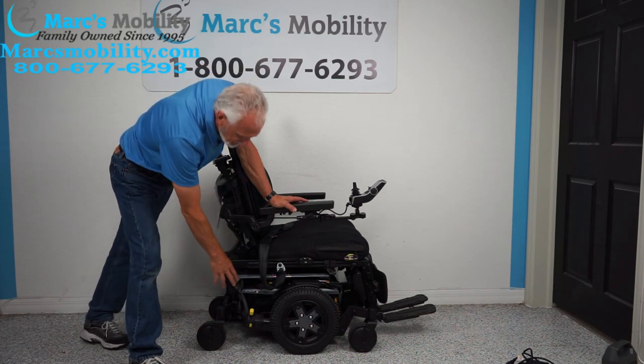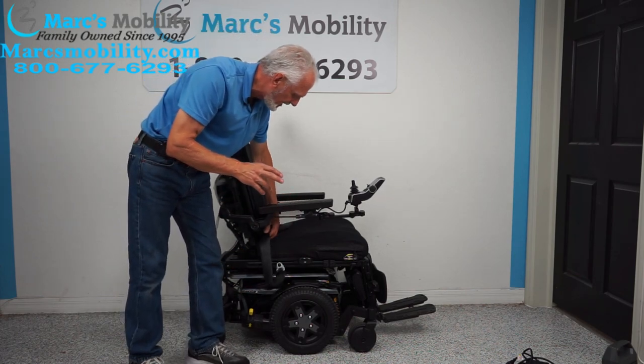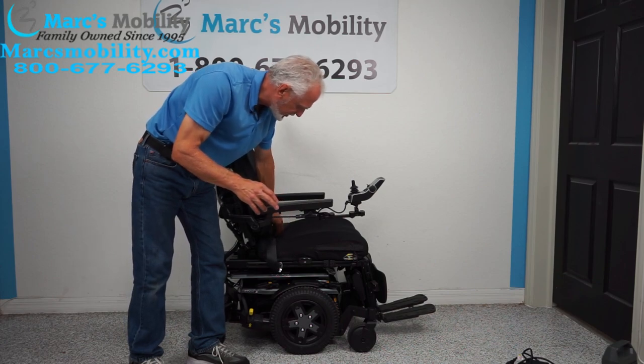If you're familiar with the Quantum chairs, these are high-end quality power chairs — very high quality, very dependable.